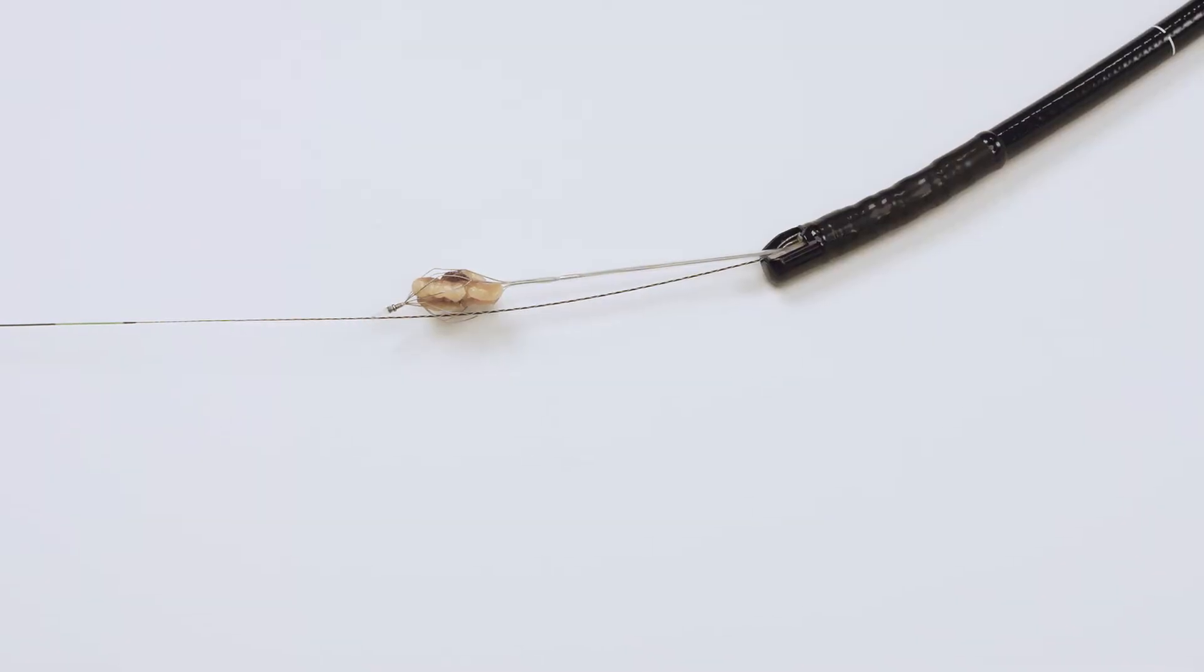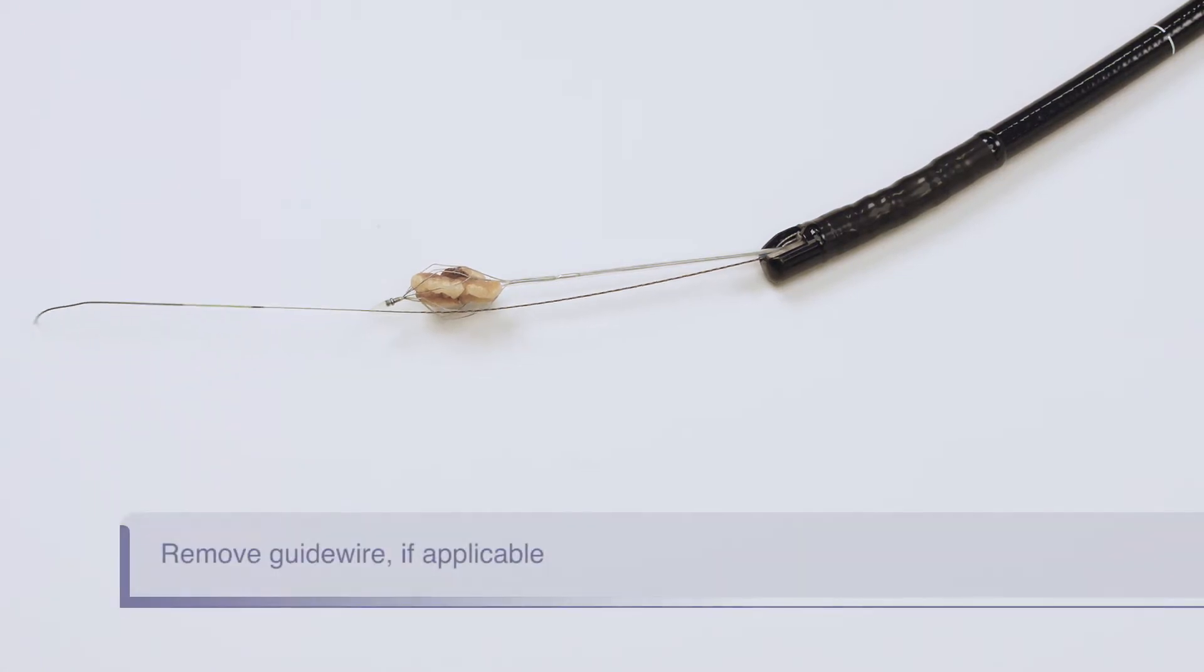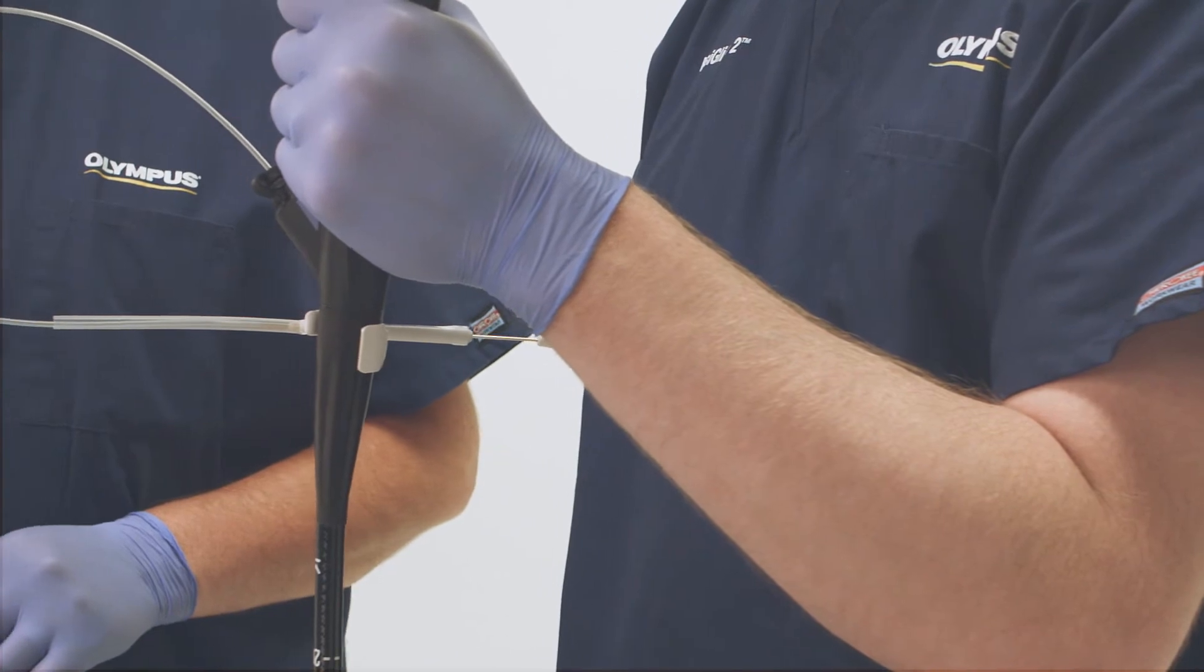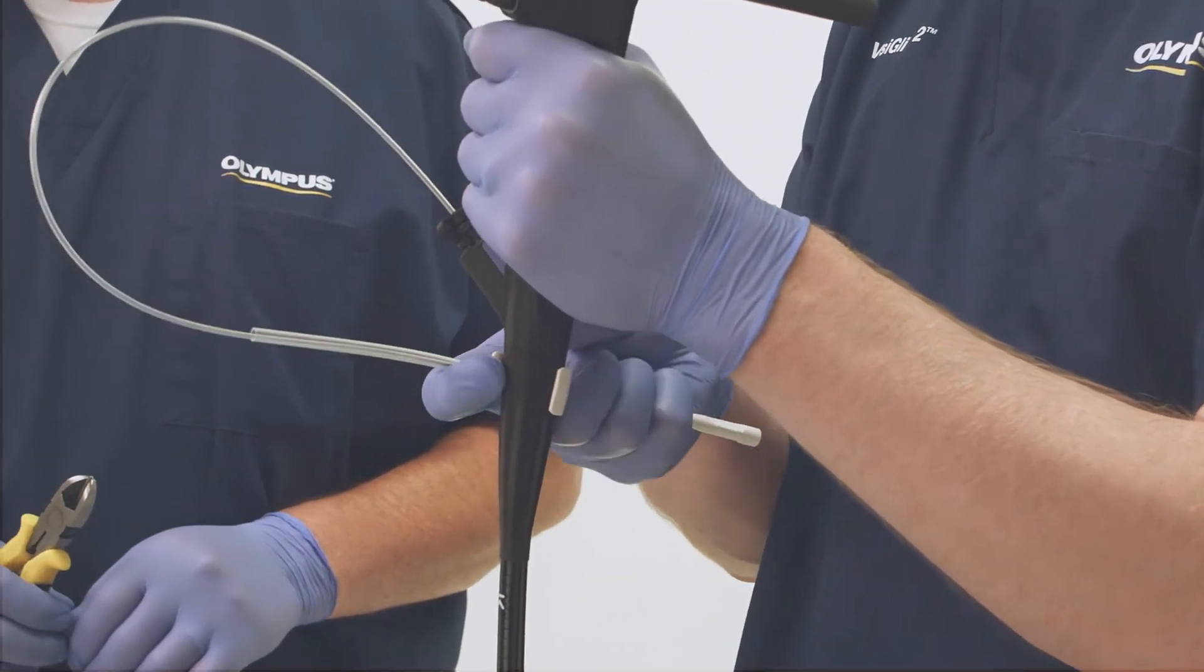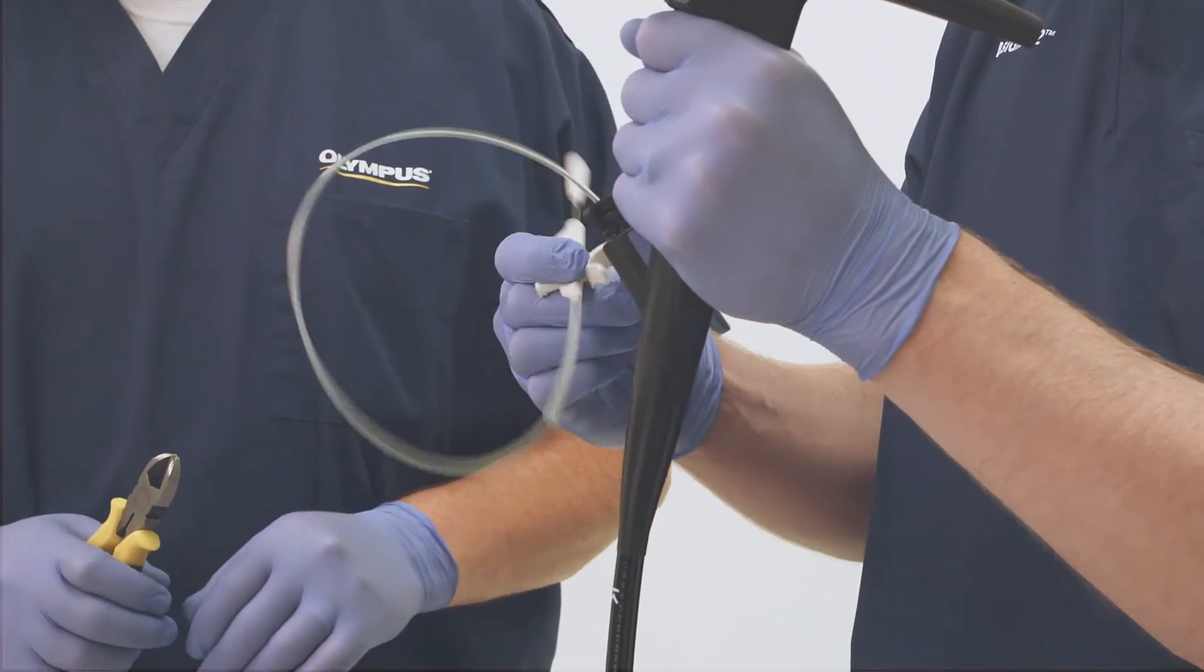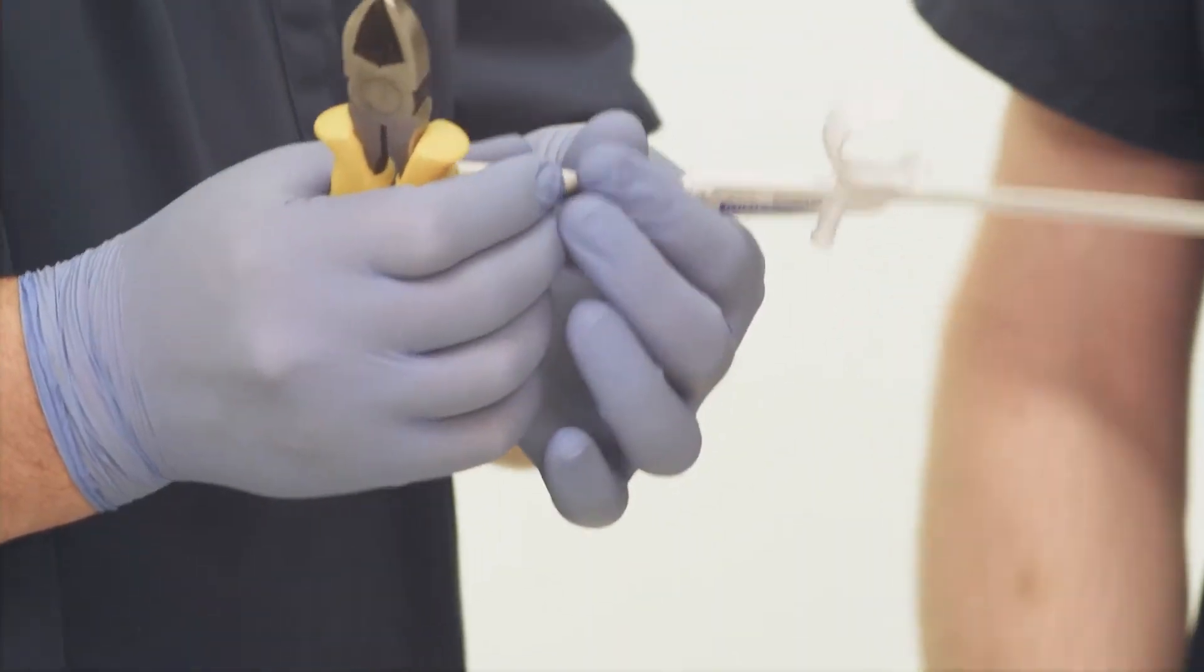In this case, we have a basket that has become trapped in the bile duct due to stone debris that cannot be dislodged. Let's prepare the basket for emergency lithotripsy. If using a wire-guided basket, remove the guide wire from the patient and scope. Separate the basket handle from the boot of the scope to facilitate removing the basket sheath and scope from the patient.